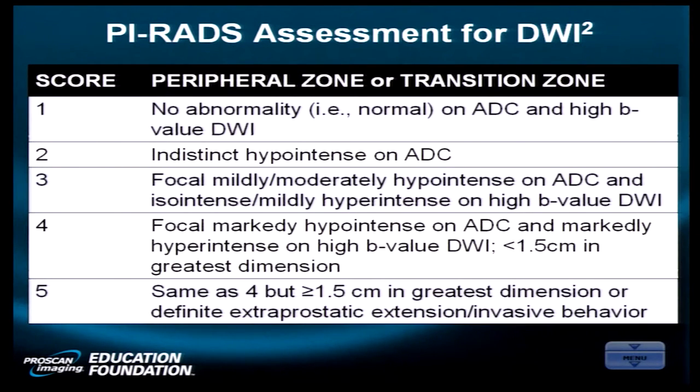It's kind of easy to think about it as B0, you don't have them on, your reference image, which is really a T2-weighted echoplanar image, then 400, 800, 1200, 1600. And you could plot a curve and see what the behavior of the diffusion is as you change that B value. You'll also see people do it asymmetrically: 0, 50, 150, 450, 900, 1600.